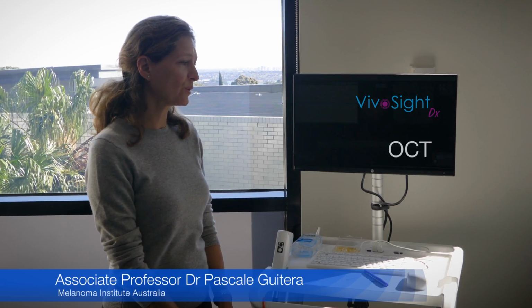I've done the first study with OCT where we biopsied all of these little pinkish things because we wanted first to learn, and also it was a study, so we had to have a gold standard. And I've been very surprised that a lot of things that we were thinking were superficial BCC were not. We found one amelanotic melanoma that was absolutely impossible to diagnose. It was not looking like melanoma in any way. And a lot of things were other things, so granuloma, actinic keratosis in particular, a lot of things can mimic. Most of the time it's okay, you make a mistake and you see the patient 6 months after and you can correct your mistake. But for example, this melanoma was already 8 millimeters, so if we hadn't biopsied or just done cryo quickly, I don't know what would have happened.